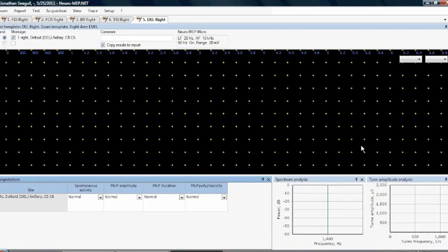Same thing for the lower extremity, exactly in the same order. Once you're done with that, you can go to the report, or you can finish the exam and take it up some other time, continue it. So basically, that's the needle exam and the upper extremity. Lower extremity essentially follows the same principle. Let's go over the screen.